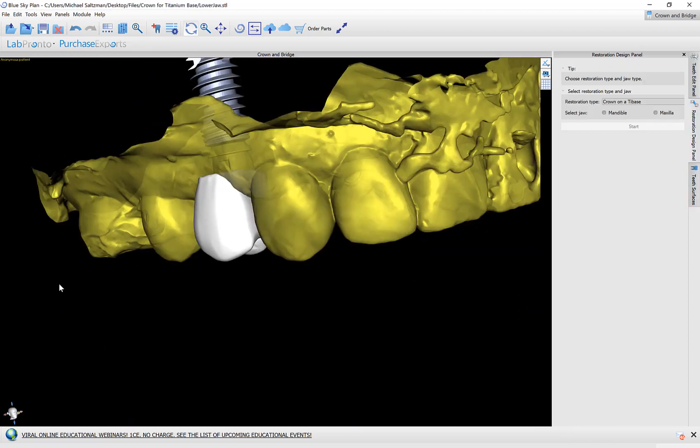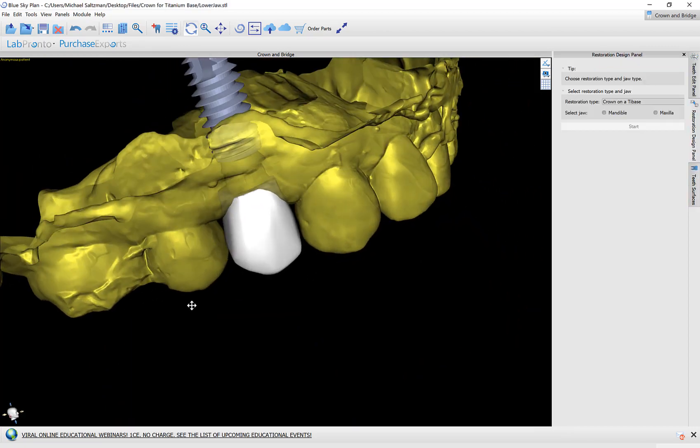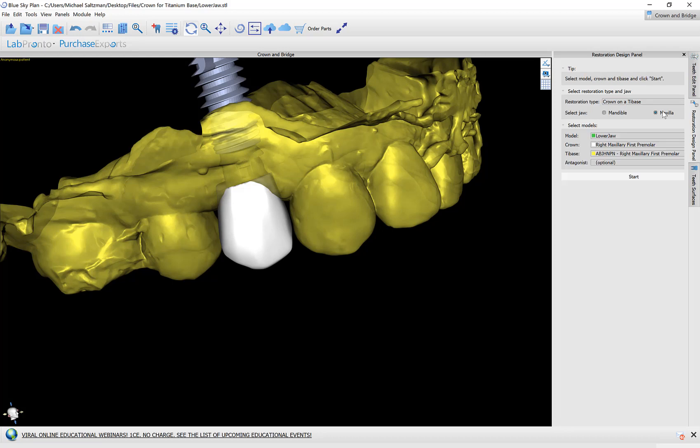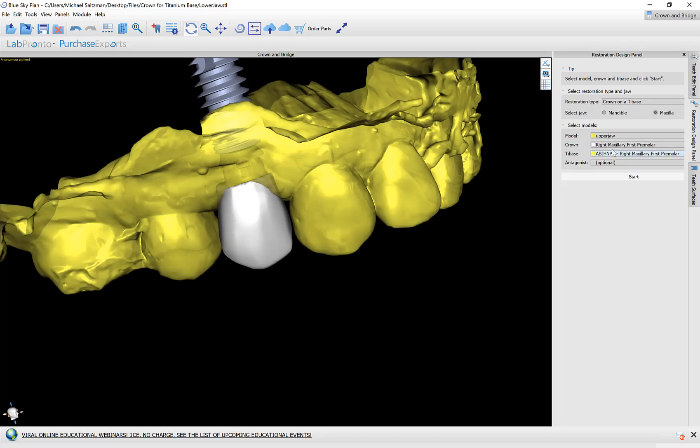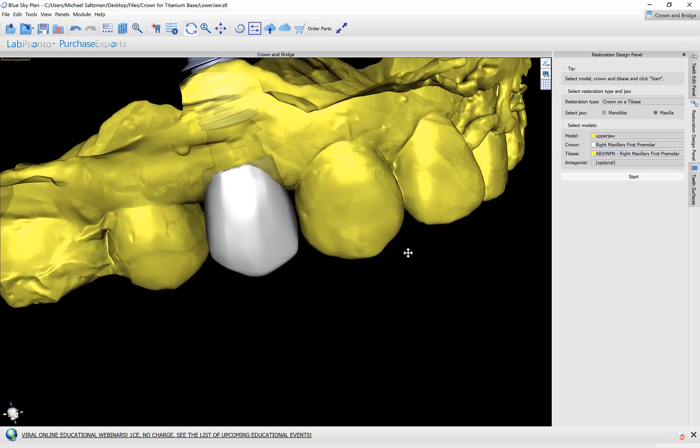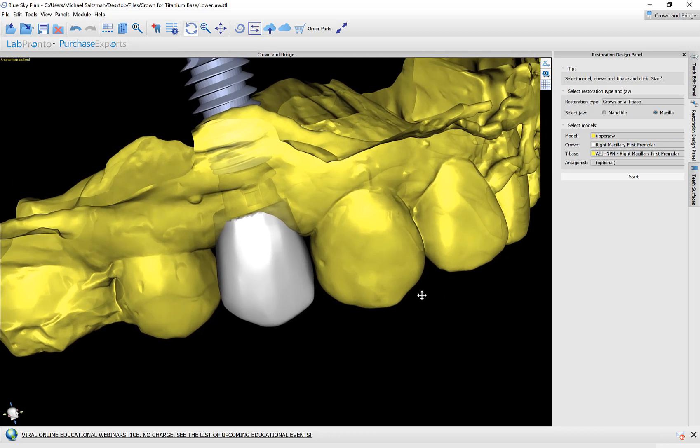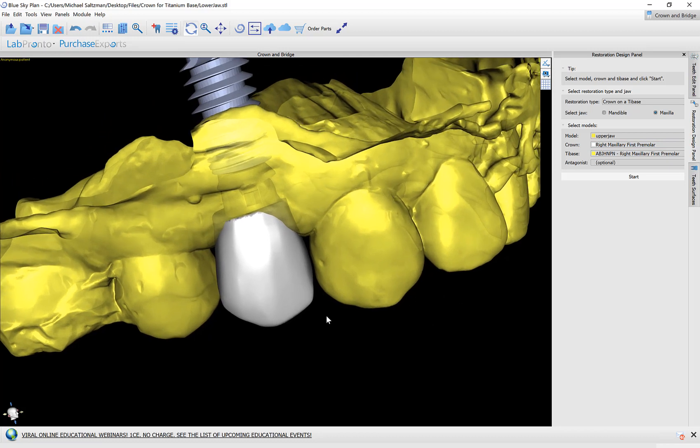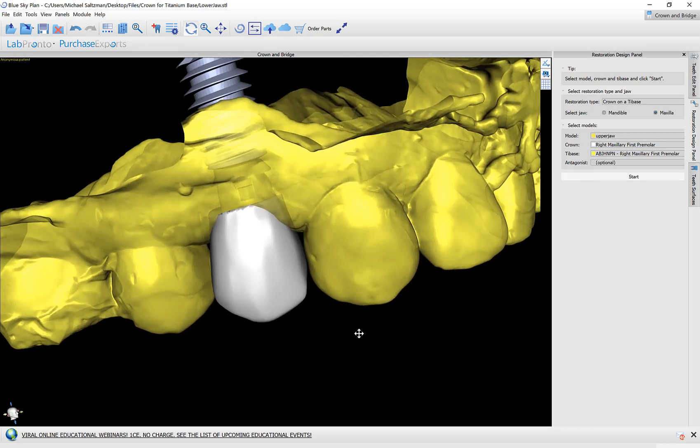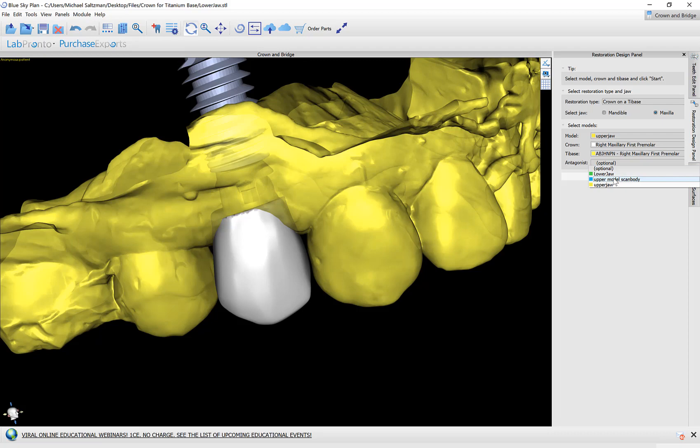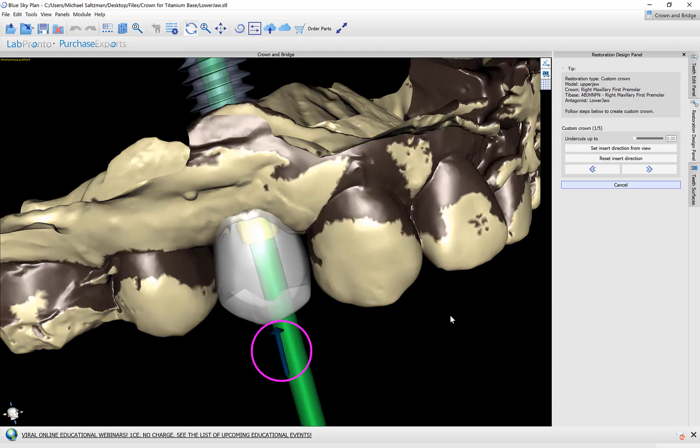The process of creating the crown is simple and straightforward. Select the relevant restoration type. The relevant jaw type. And now we're going to select the correct model. The crown and the tie base are selected by default. If you are creating multiple crowns, then you could click to activate the relevant crown and abutment. And you could select the opposing arch.